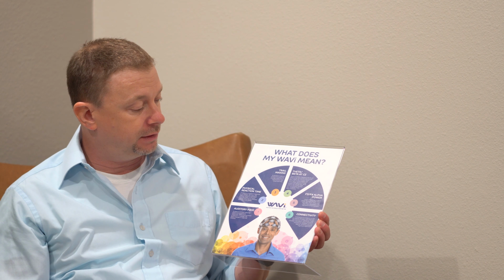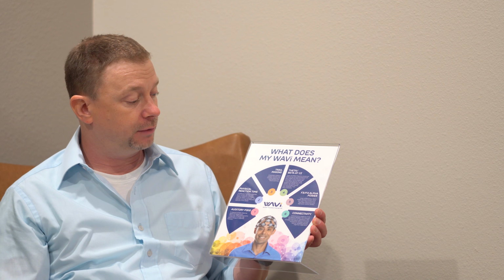Connectivity is the last one, and connectivity is probably the one that I spend the most time talking with clinicians about, because this one is very clinician specific. This is very dependent on interpretation, and it's not easy to explain to a layperson. However, connectivity is also called coherence, and it has to do with how connected different brain areas are to other brain areas.